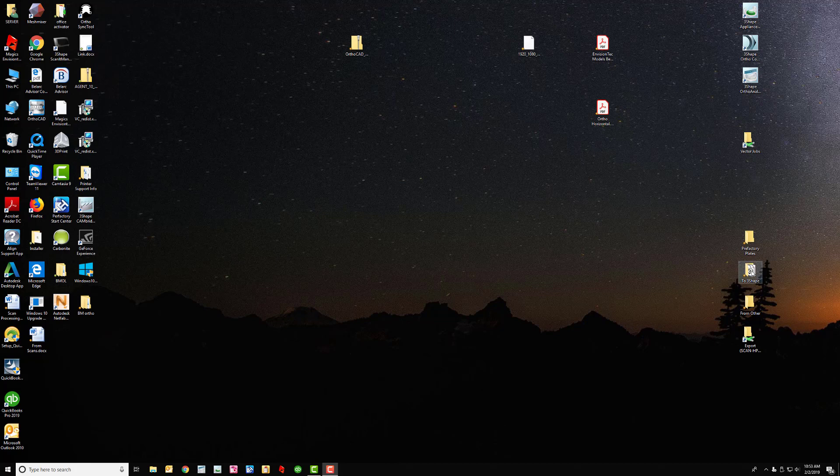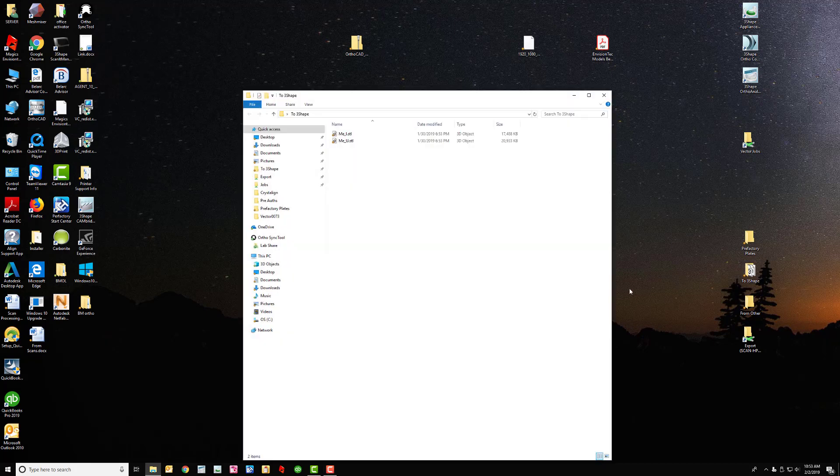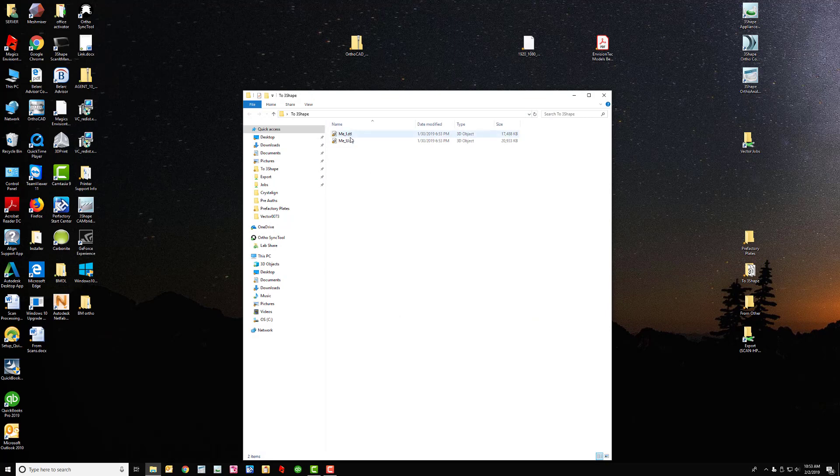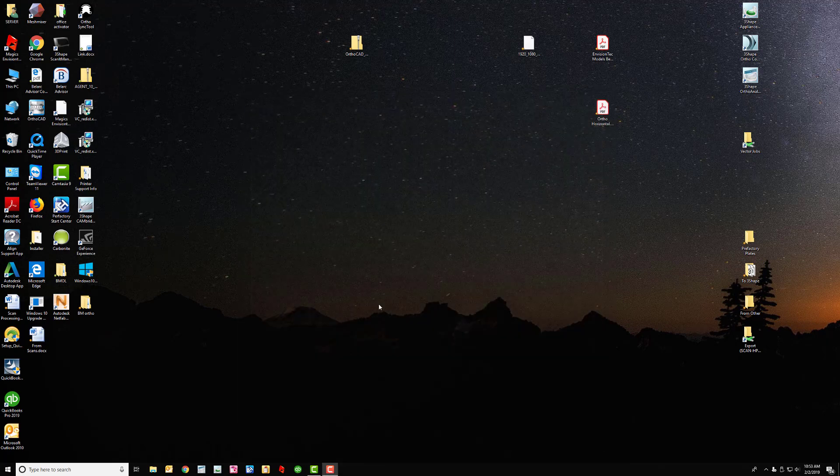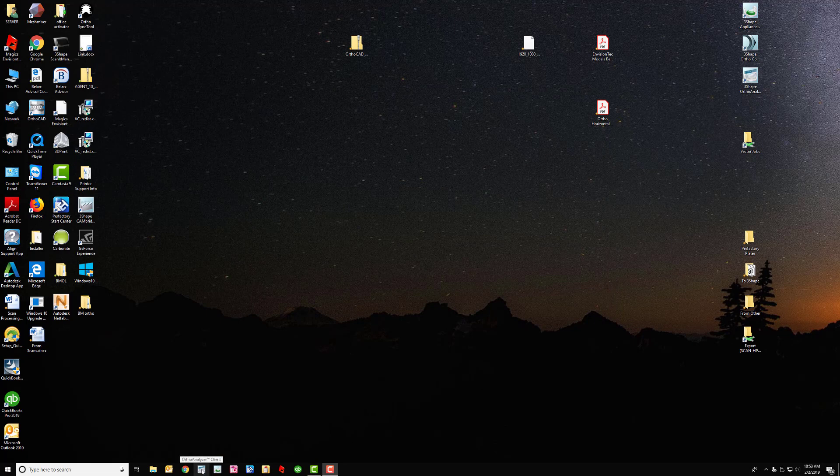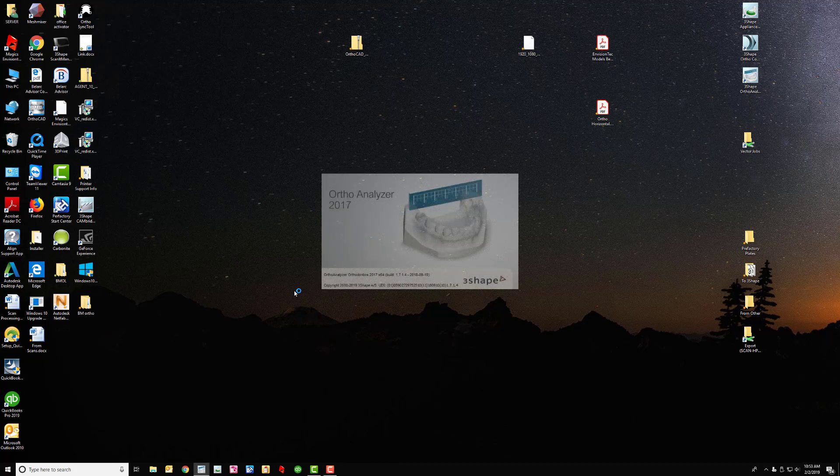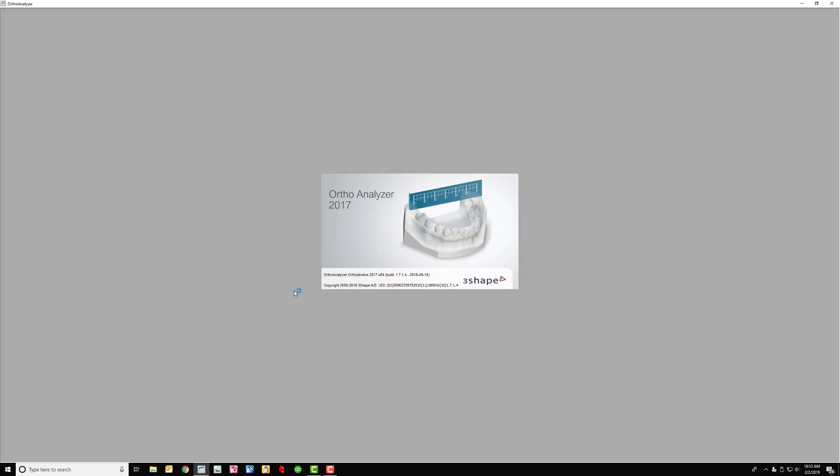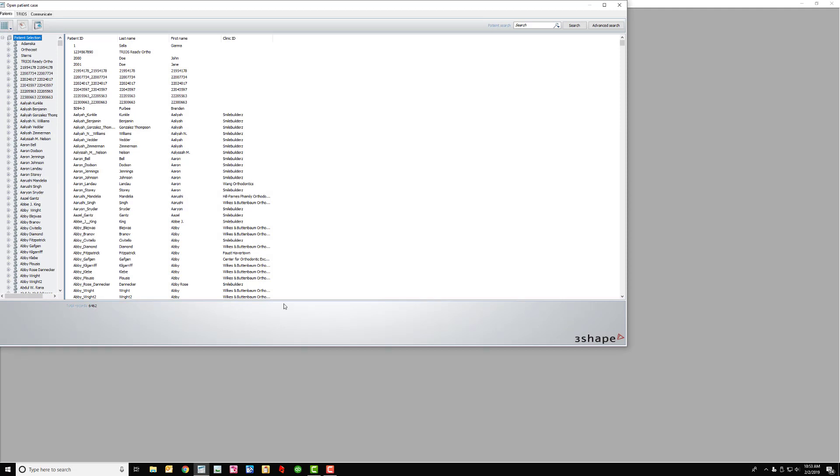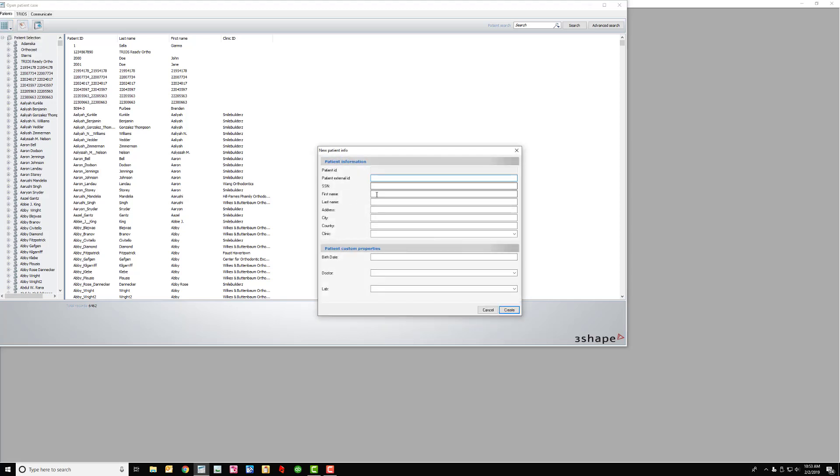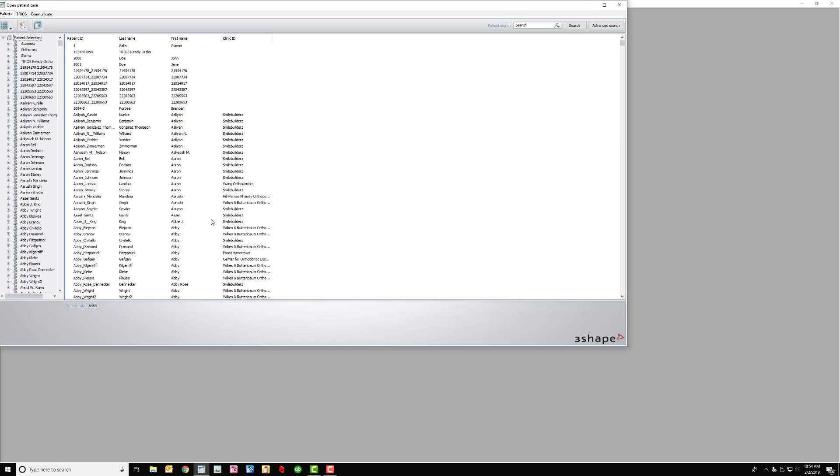So already in here to 3Shape I have me. The first thing that I do is I open up Orthoanalyzer, which I really shouldn't have to do. Right now I have a bug. I should just be able to do this all in Appliance Designer but right now I can't. So the first thing that I do is create a new patient: Chris Gajewski, because I've done this so many times. Create.